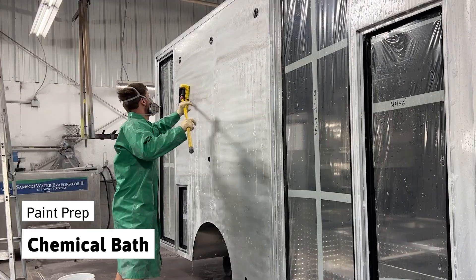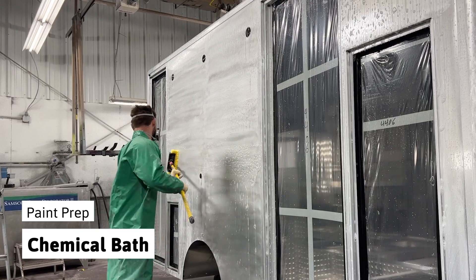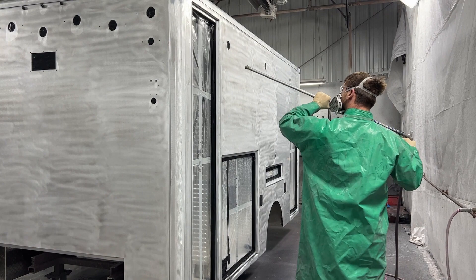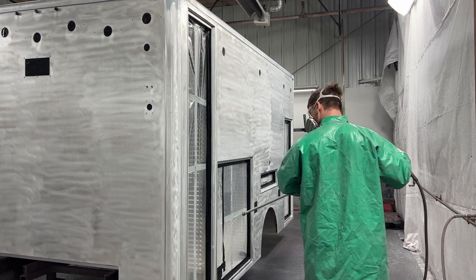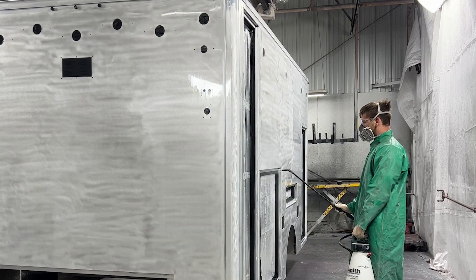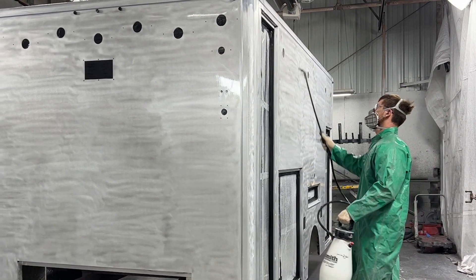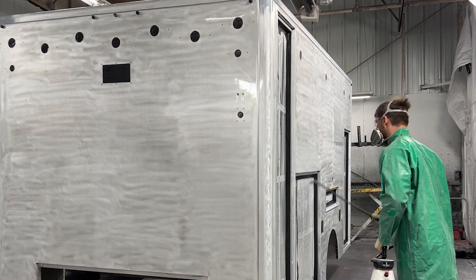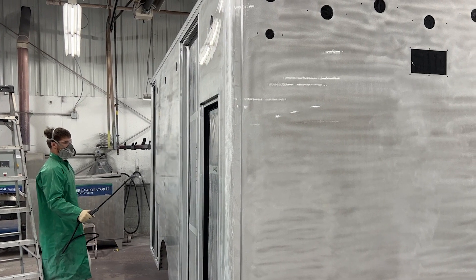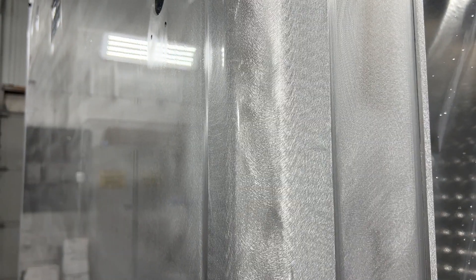Next, the body enters the chemical bath stage. In this stage, the body is washed and dried to remove any dust or debris. Two corrosive chemicals, Gardo Clean and Gardo Bond, are used to open the pores in the metal surface and further enhance corrosion protection and maximize paint adhesion. This step is imperative to the longevity of our ambulance body appearance as well as minimizing future corrosion damage.